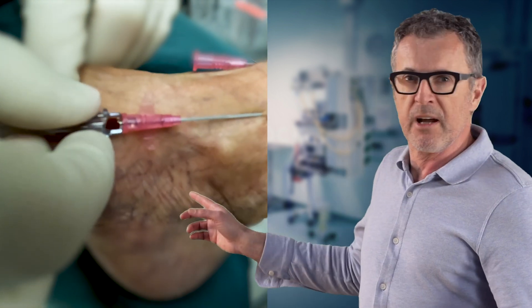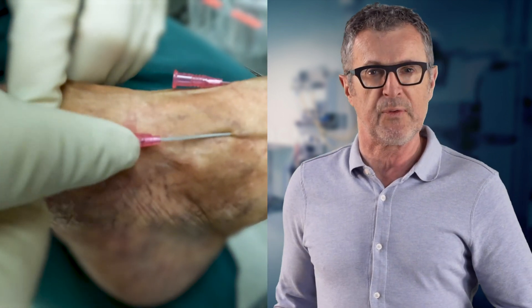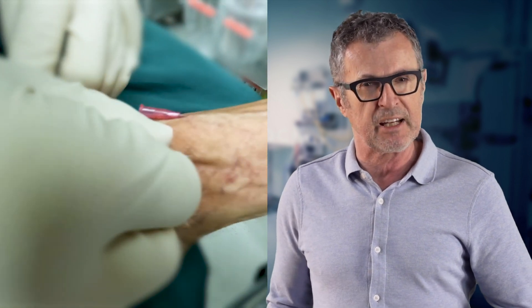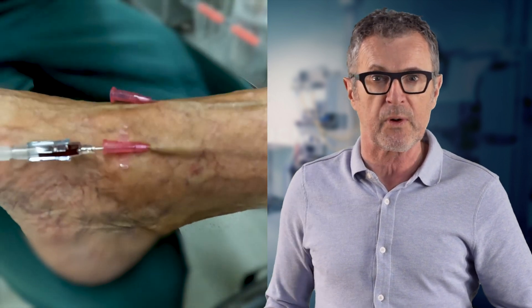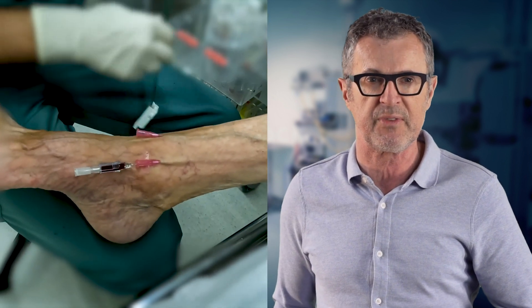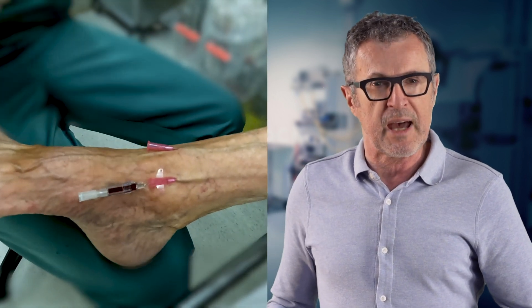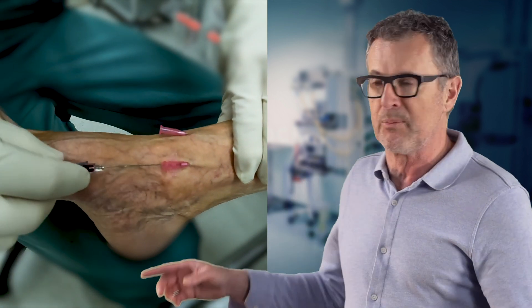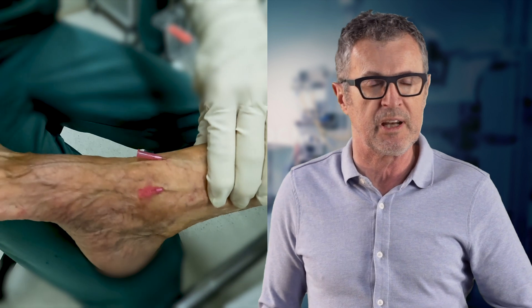Note the very low angle of insertion that made all the difference. The IV catheter with the needle is inserted at least about one centimeter before threading the catheter over the needle into the saphenous vein. You want to make sure that your catheter and needle are at least one centimeter inside the vein before threading the catheter over the needle.